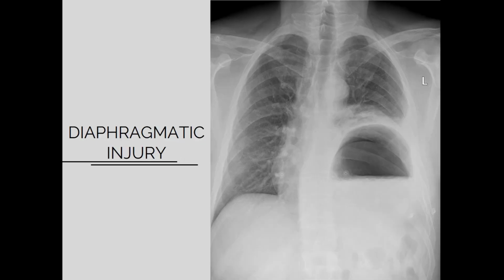Okay, another thing that I wanted to tell you, because there are two ways I have told you how the diaphragmatic injury presents. Other way that you can notice the diaphragmatic injury, for example, if you have passed the nasogastric tube, this nasogastric tube may be visible in the thorax, because that may be coiled up here. If you have passed the nasogastric tube, that won't be at its normal place on the downside. So by that coiled nasogastric tube into the thorax, you can also say that there is diaphragmatic injury and the stomach has gone up into the thorax, okay.